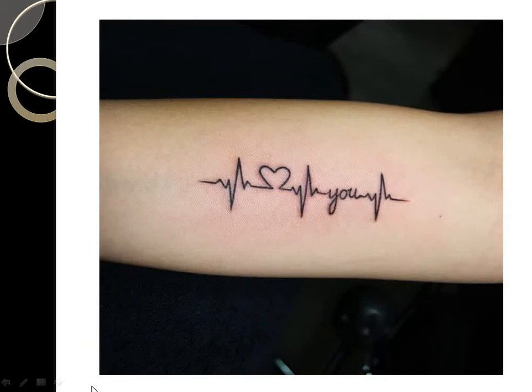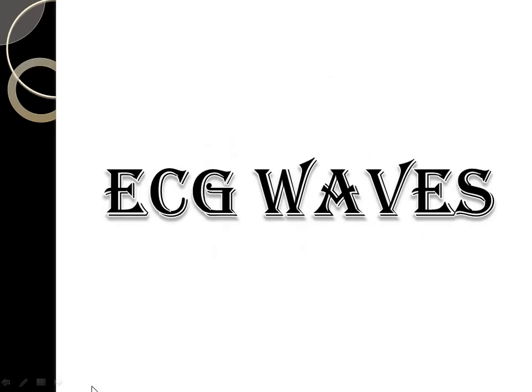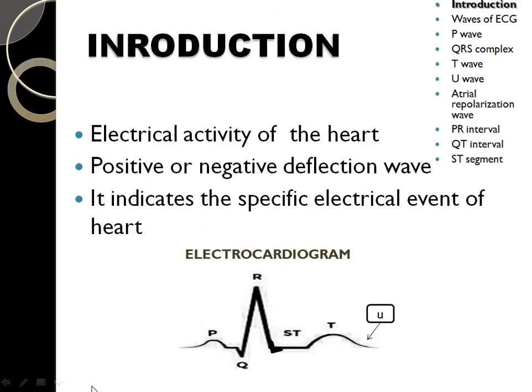Did you draw this in your hands or in your notes? What is that? That is the ECG wave, electrocardiogram. Electrocardiogram means the electrical activity of the heart recorded from the surface of the body. This produces the positive or negative deflection waves. It indicates the specific electrical events of the heart.